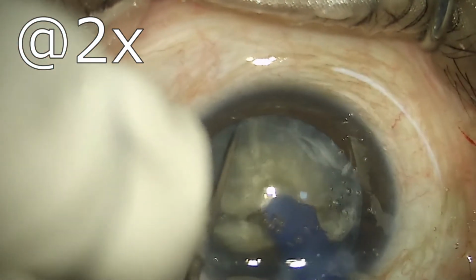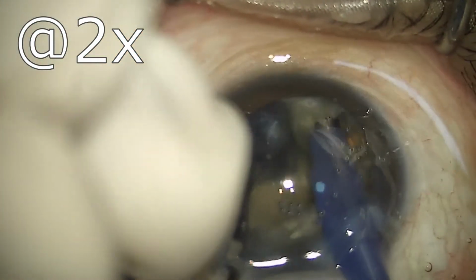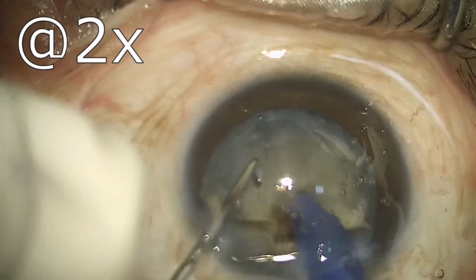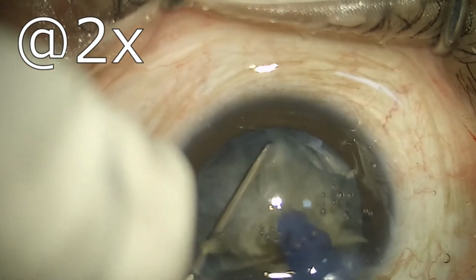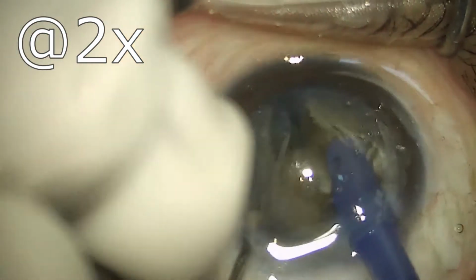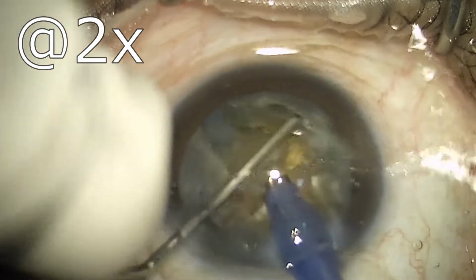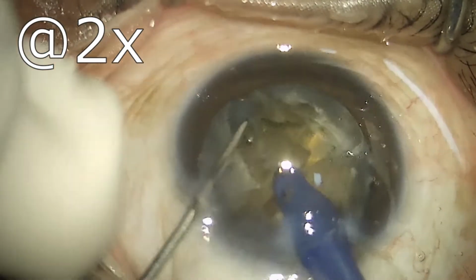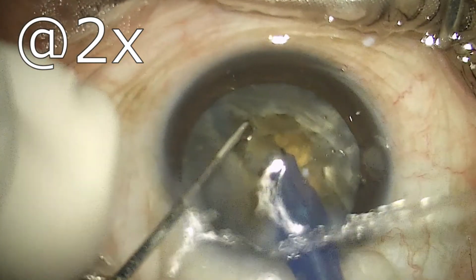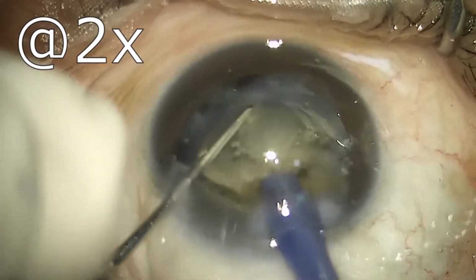If the purchase or the penetration of the phaco tip is more than 50% of the depth, you get a nice crack which is through and through in the first go, which is so very relieving if you have a first crack which is full thickness in such a cataract. At times there are these hard inside cores which, if separated out, can be emulsified before proceeding to take out the outer core.